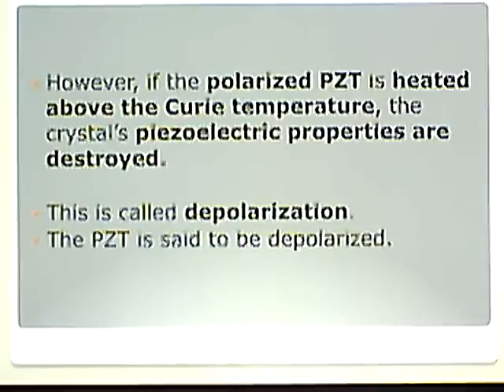So we make it with heat, but we can't heat it any higher than absolutely necessary to give it those characteristics. If we go any higher than that, past that Curie point or Curie temperature, we immediately destroy those piezoelectric properties, or its ability to turn sound into electrical or electrical into sound.